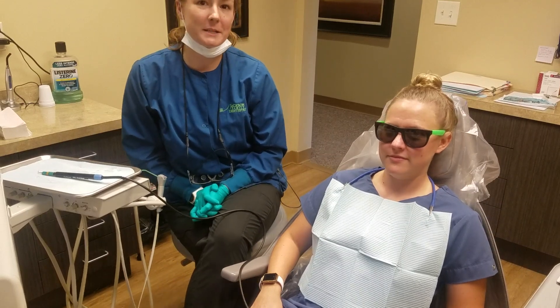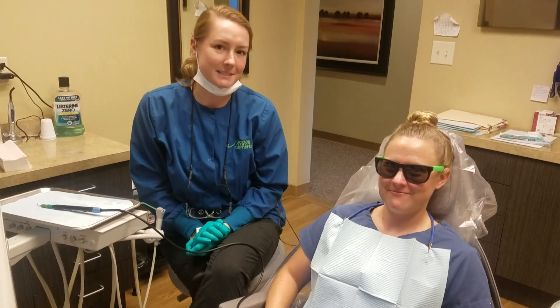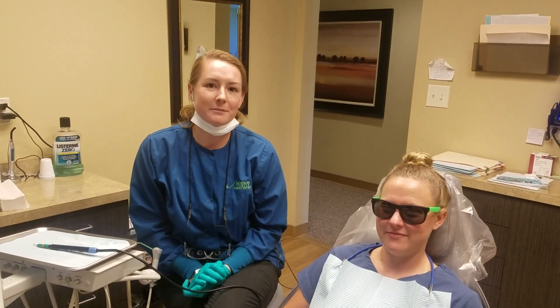Hey guys, I'm Ellie at Jackson Family Dentistry. This is Kelly — she's one of our assistants and she is volunteering for me today.